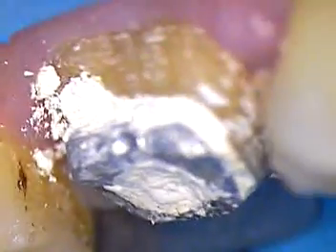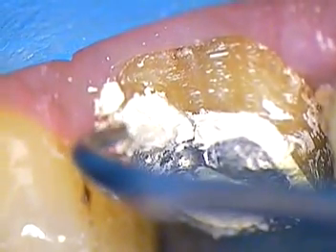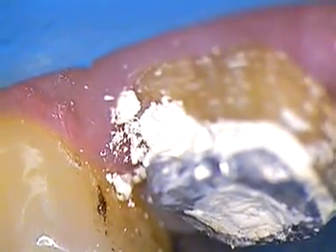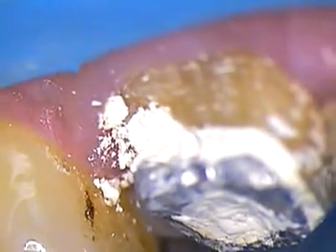We've got buttons for buttons here and switches for switches. Let me just make sure we're right in the middle of the picture so you can see that at home. We had a little water issue, so we tried a different handpiece. Now we're on and we've got plenty of water. There we go.